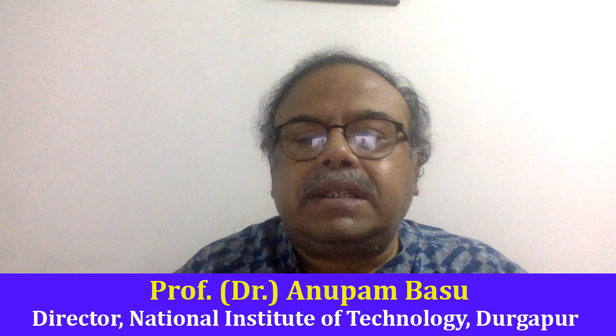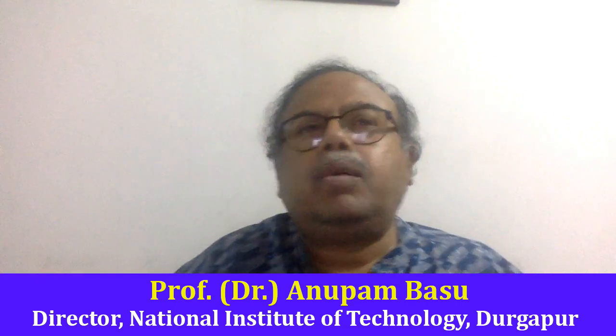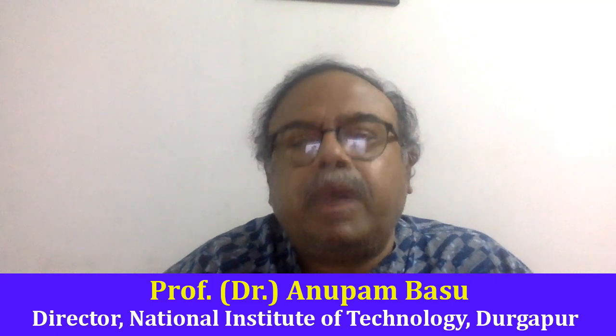But in principle, we have to separate out the nitrogen, and in our experiment we have used zeolites. As I had said, the quality of the zeolites is very important, which will determine the performance of the concentrator, and the availability of such systems also depends on the supply of zeolites and other components. Besides these zeolites, there are other electronic controls and electrical gadgets which push the air and perform different controls so that the purification is proper.